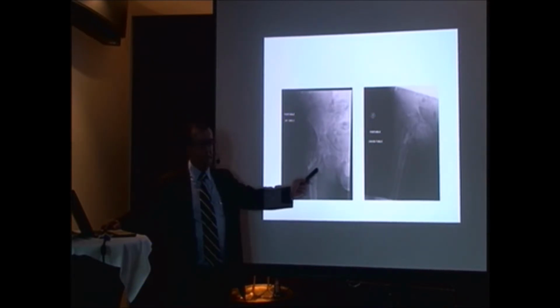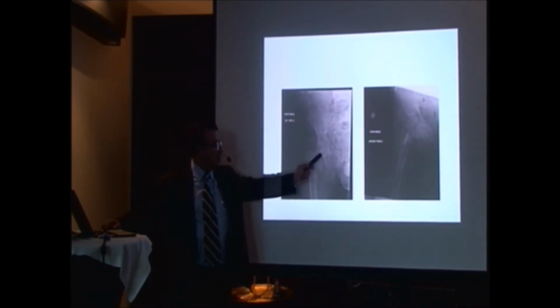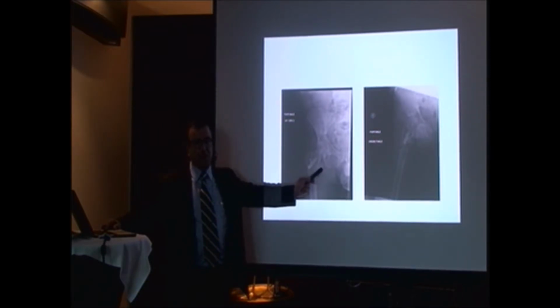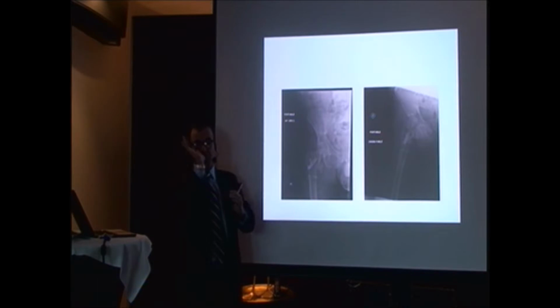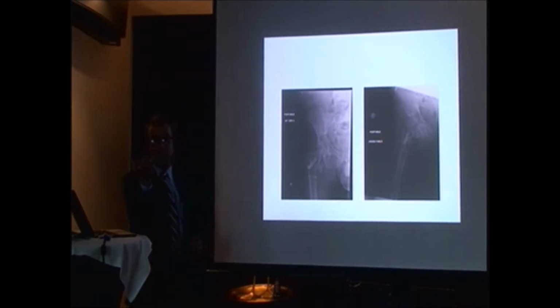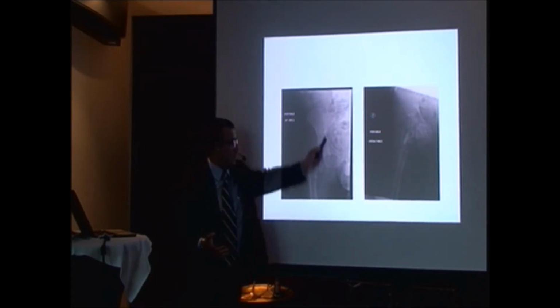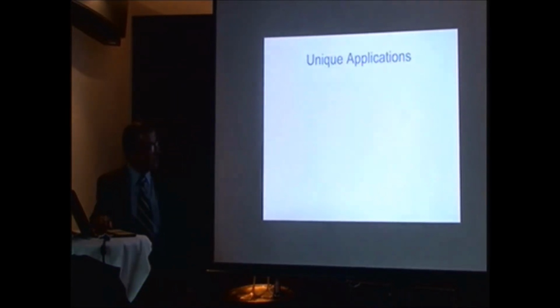What we were taught is you always want the medial neck to be over the calcar. If it's medial to the shaft, it's going to settle and you have no support. Because how do you hold a tomato? Like this or like this, right? You don't hold a tomato like this. You have to hold it like this. So this calcar is a support for the neck, which is being loaded with very high forces.